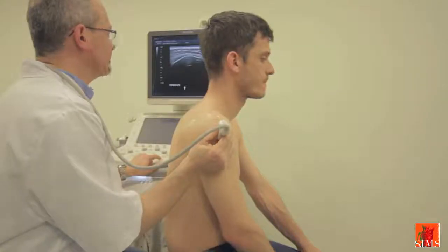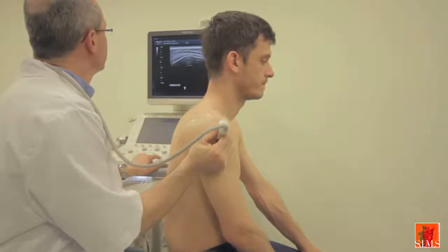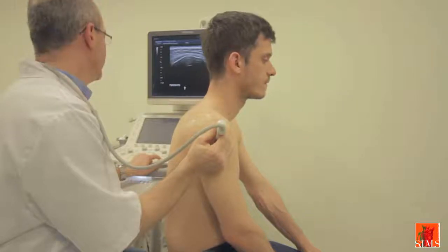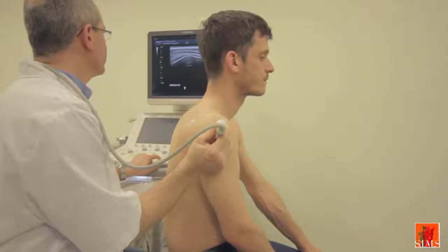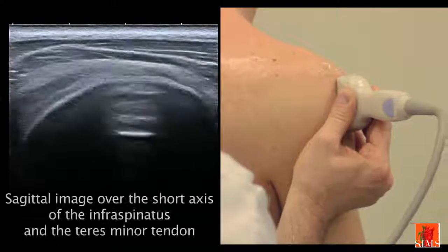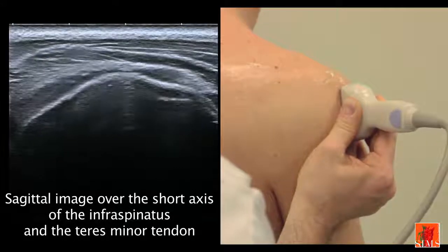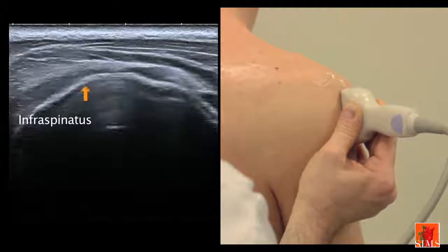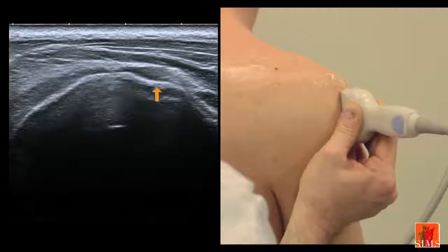We will complete the exploration of the posterior region by an analysis of the teres minor and of its relations with the infraspinatus. On this very lateral sagittal image, we can rather easily identify the oblique facet of the greater tubercle on which the infraspinatus inserts, and its vertical insertion facet on which the teres minor inserts, as shown under the arrow.